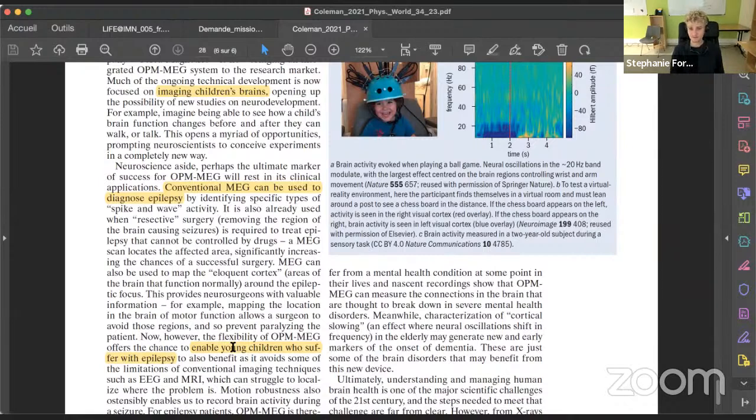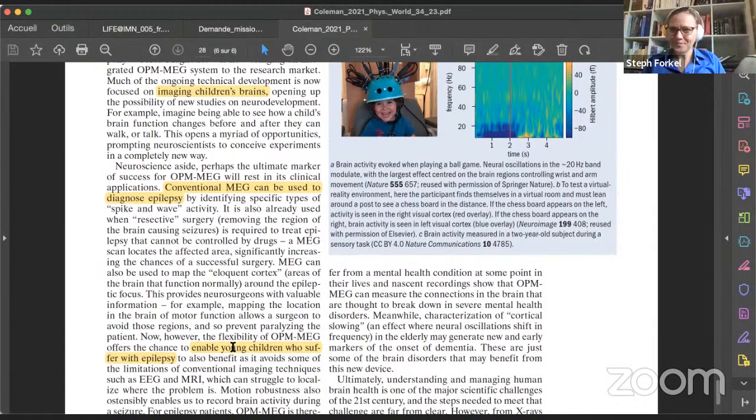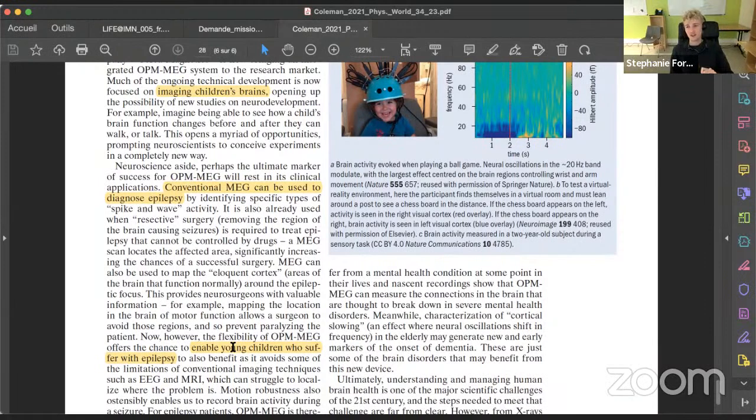Thank you. Cesare has a question as well. I want to be a bit straightforward on this, but it's a big improvement for sure, and it still has to go on the market. I was wondering if it's going to cost less than the usual MEG. I forgot to tell that it's going to be extremely less expensive, because a MEG usually is about $2 million, I think. And this will be a few thousand or 100,000, I don't know exactly.